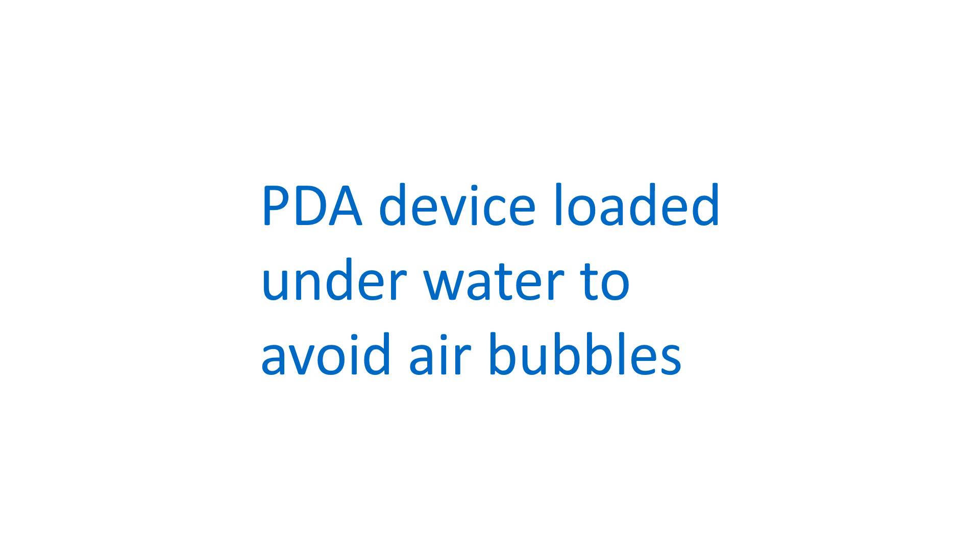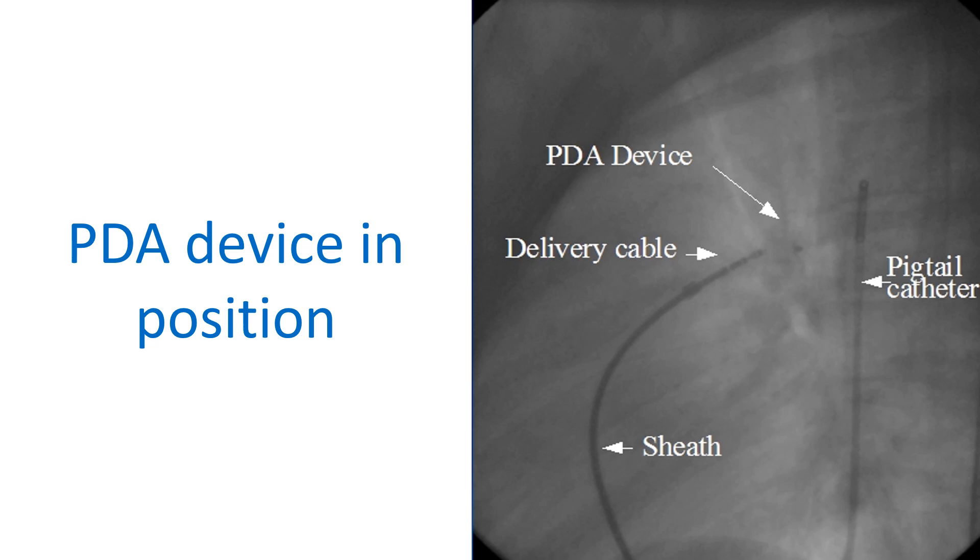The device is pushed out of the sheath in the aorta and the assembly is withdrawn so that the device is deployed in the PDA. A fluoroscopic image shows the PDA device deployed in the ductus.